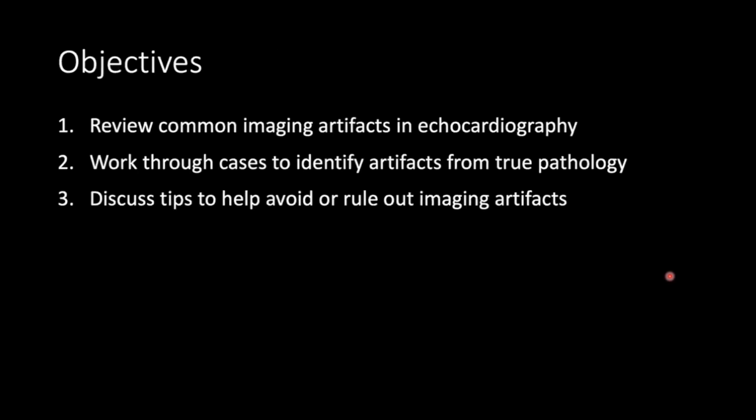In terms of objectives, we're going to review some common imaging artifacts. By no means is this going to be a very comprehensive talk on artifacts. There have been many talks on the SMH Echo YouTube website, and Dr. Chow has done a whole bunch of them too that you can look at that talk more about the physics. So we're just going to work through some quick cases, and when relevant, talk about some tips.